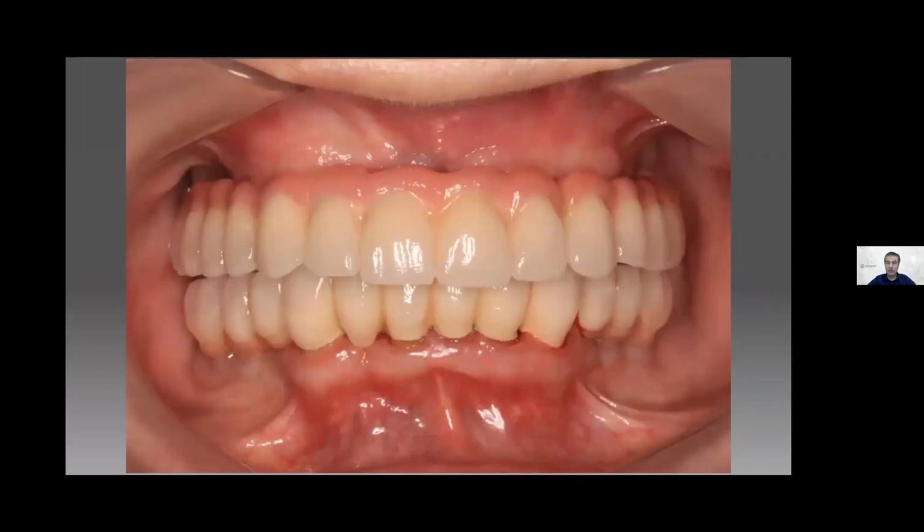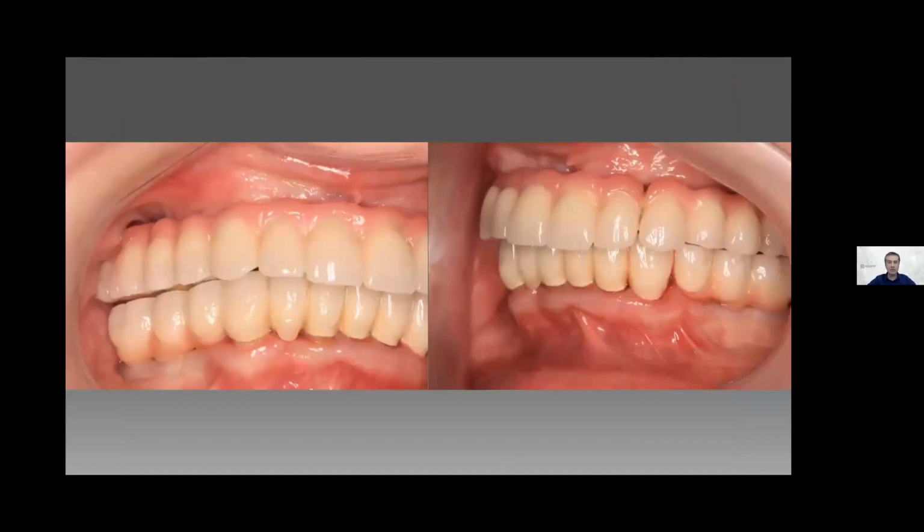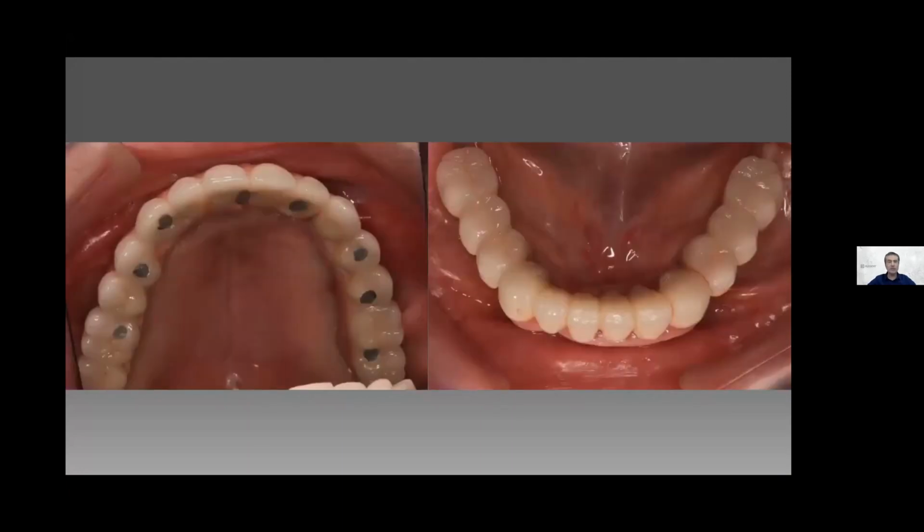We decided before to make full ceramic crowns. So for that, we placed 8 implants, but I don't know why the prosto department moved to a hybrid. Maybe they didn't have enough lip support, I'm sure, for that. So it will end with a hybrid prosthesis. This is the left and right side, and this is the upper and the lower. And here the smile of the patient.